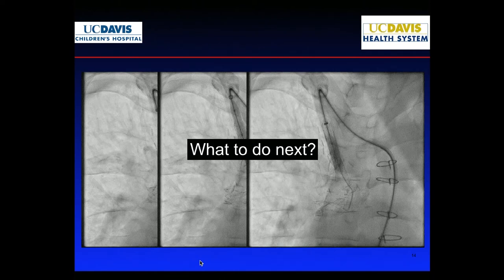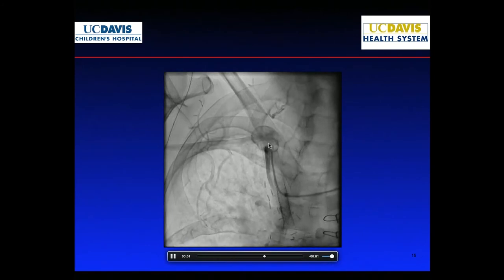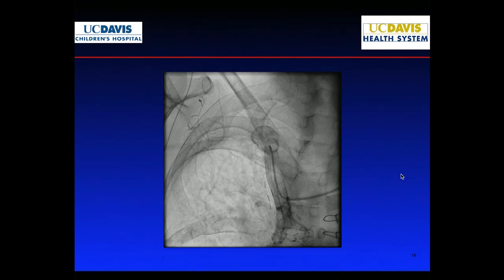And in that sense, he says that the surgeons sometimes use axillary artery cannulation. And I thought, hey, I never heard of that. So we went ahead and did this. So we brought the patient back. But before we did that, we took this picture just at the end of the last case to see what that vessel size is. And let me just play it back. So it's actually a pretty good size axillary artery here. And so we went ahead and did this.